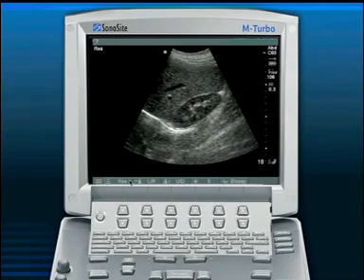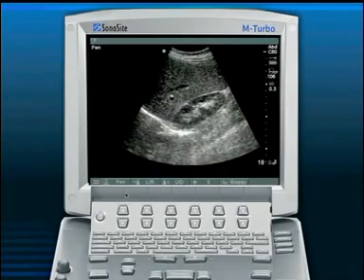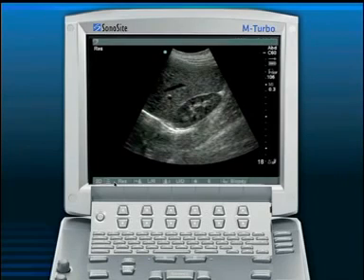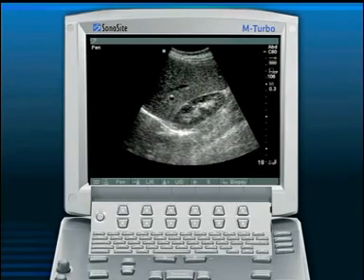And if you notice, the dots got a little bit closer together, or more resolute. If I push this button again, I'm going to go to the penetration mode, which is the lower frequency setting. In this case it would be the 1 megahertz setting, and the dots got a little bit more spread out from one another. If I go back again, here's resolution, here's general. I'm going to take the frequency up to the resolution mode and then down to the penetration mode. So gen, pen, res: the three frequencies between which each transducer can toggle.